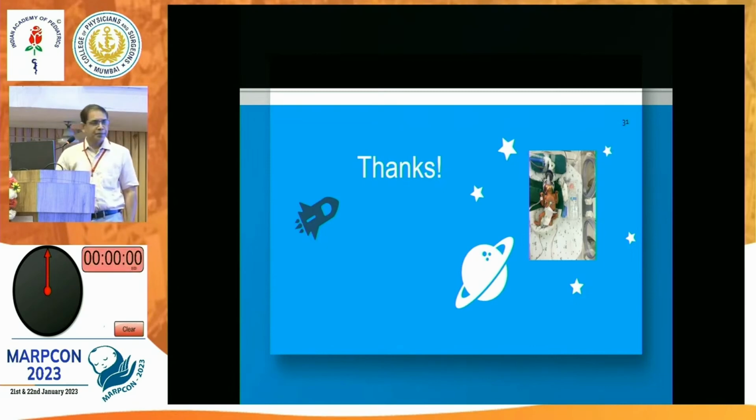Thank you. So I have a question to ask you, sir. Does HFNC increase the infection rate compared to conventional CPAP? There are no studies to show that. There were a few concerns, especially with the UK trials, which showed that when they initially used humidification, those organisms were associated with improper humidification.